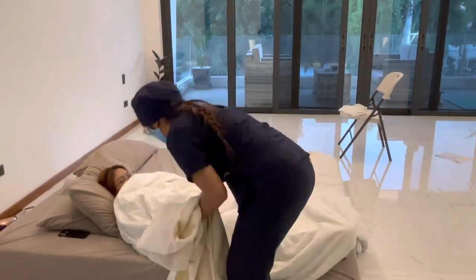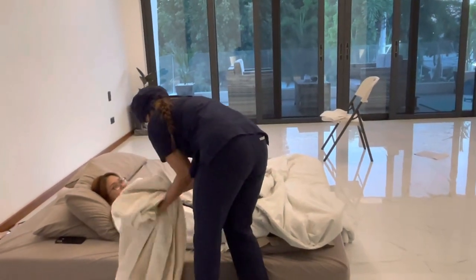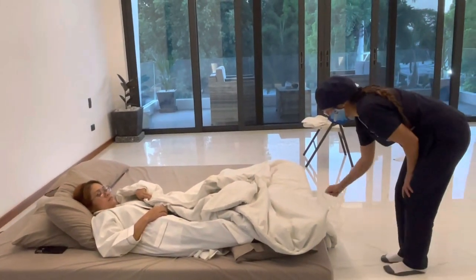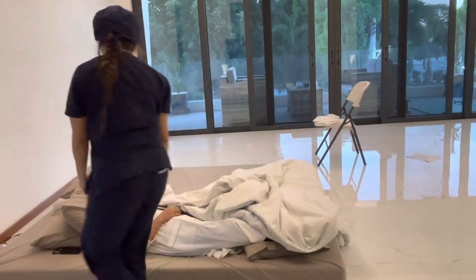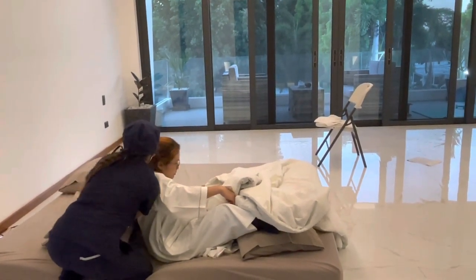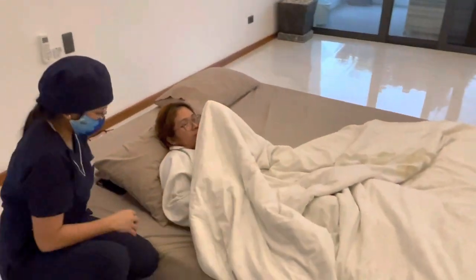If the patient is not capable, assist the patient. Raise the head part of the bed to assume a semi-sitting position. Rationale: in supine position, the bladder will not be pressured to excrete fully. Position the patient properly, instruct to flex both knees, and stretch both arms on both sides of his or her body, palms pressing the mattress.